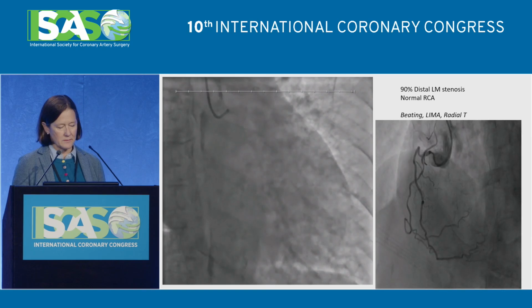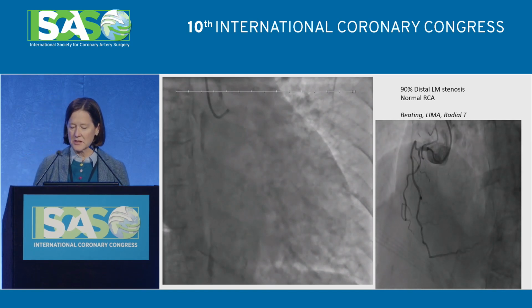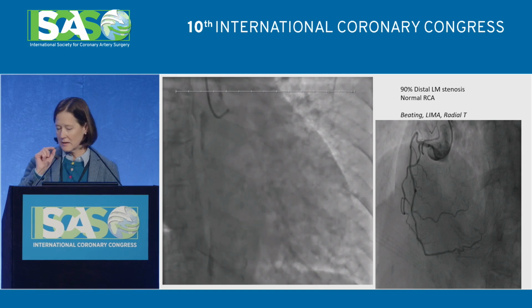You can also make out in the left injection the descending aorta, and in the right injection, there's quite a bit of calcium in the ascending and descending aorta. And I put what I did in this case on the slide, but I should have probably hidden it. So in this patient, isolated left main, I think complex left main, and then normal right.